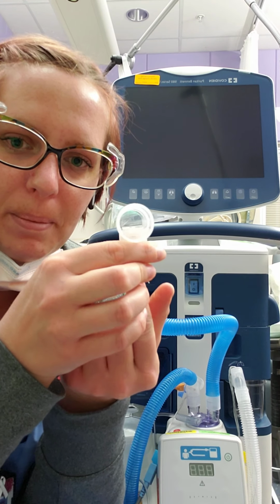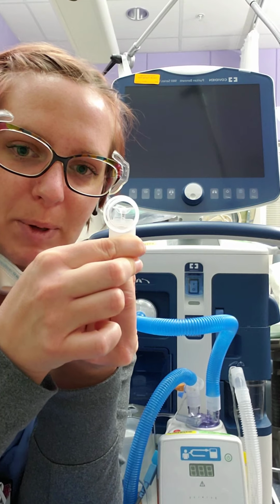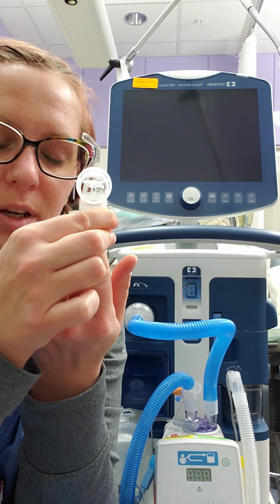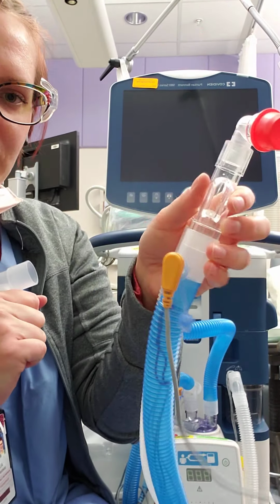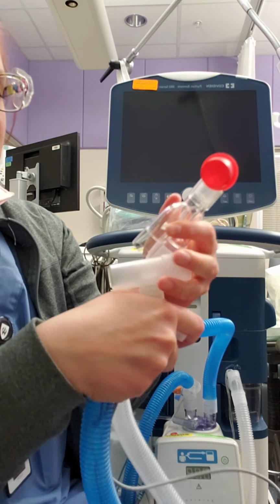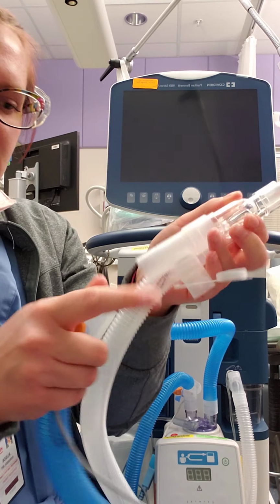That one pushed up. It will open up to allow that aerosolized medication to enter into the airway. This will be administered by an SVN. Again, we have our inspiratory and expiratory limb. This will fit right before the Y.